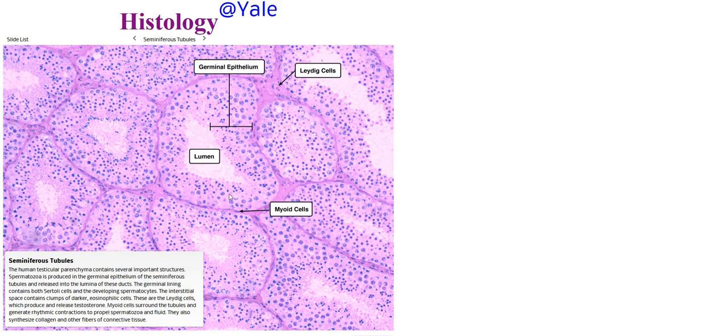We're going to see lots and lots of epithelial cells just lining the lumen of these many seminiferous tubules. There are a couple types of specialized cells, and one of them is pointed out on this slide. Between the tubes, there's going to be a little space, and usually it is darker stained. This is where our Leydig cells are hanging out. They will be a little larger, usually they'll have a dark purple nucleus, and they fit in between the spaces between the tubes. These Leydig cells are producing testosterone.